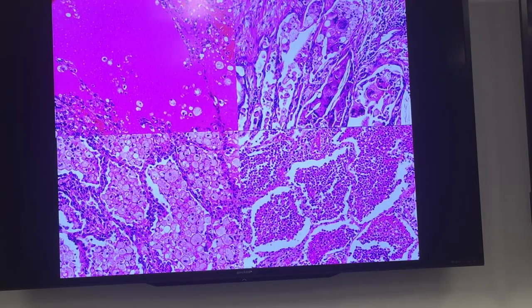All right, so here are some examples of things that happen in the air spaces. Give me your best guess, guys. Top left? What's that? Edema. Yeah, so edema is a classic airspace process. The heart fails, things back up, and it just exudes into the airspace. Patient gets very severely dyspneic and short of breath. So that's edema.